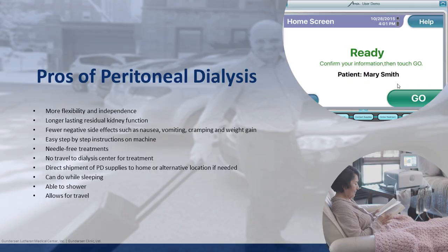So Ashley, what are some of the pros of peritoneal dialysis? Pros to peritoneal dialysis, there's actually many. It offers you a sense of freedom. I know that it's a big lifestyle change for you to transfer over to dialysis in general, but you are able to travel on peritoneal dialysis. It comes with a traveling case.